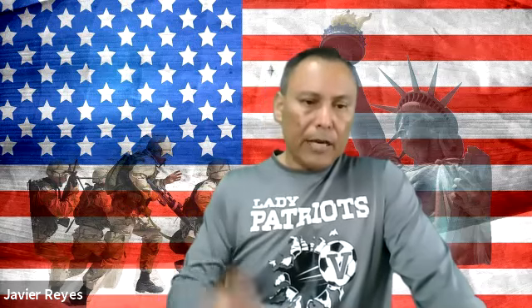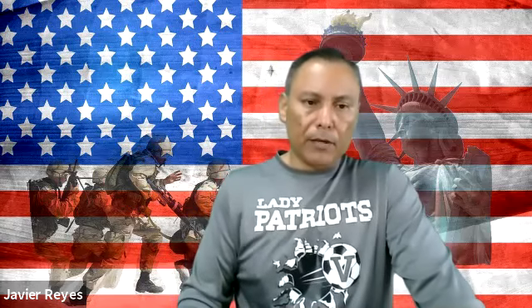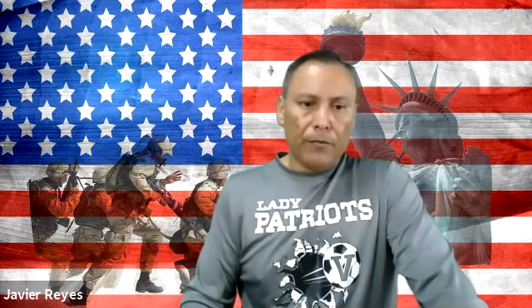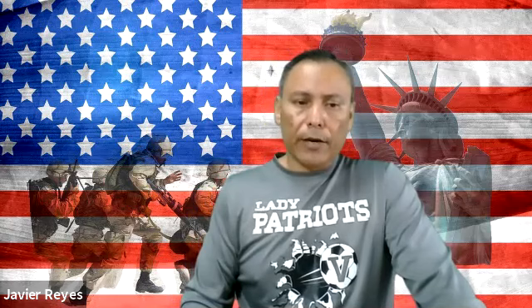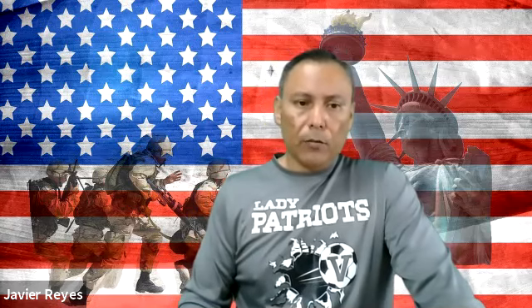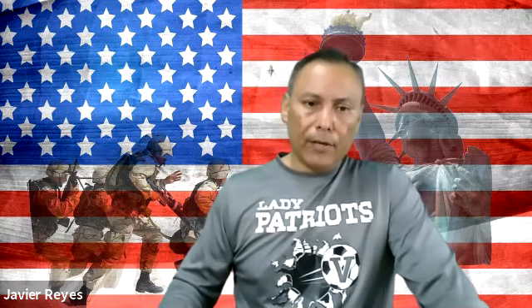No, it means that you can have it in the tube up to 24 hours. Because the sodium fluoride keeps the cells from eating the sugar, it'll be fine. Nothing's going to happen to the specimen, right? But if you collect a glucose level on any other tube that's not the gray, it doesn't have sodium fluoride. So what's going to happen to the sugar? The cells are going to eat up the sugar. So you're going to have inaccurate results.